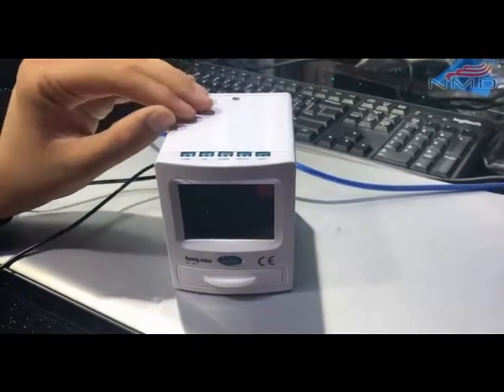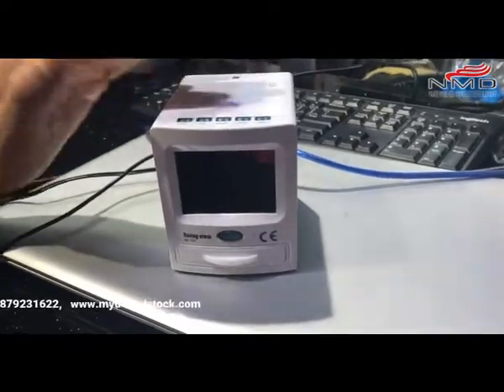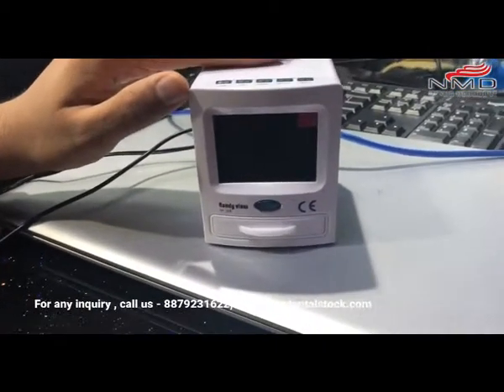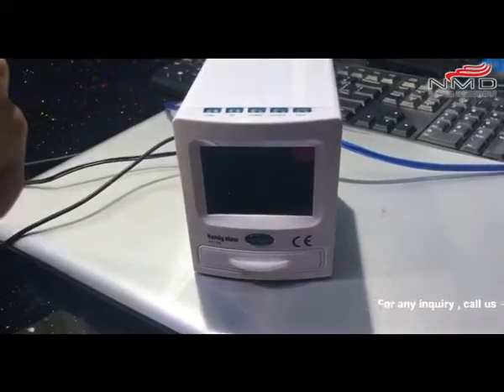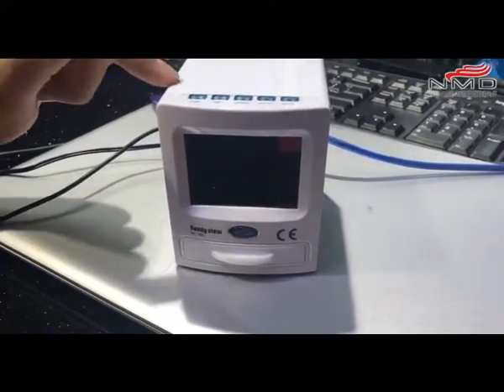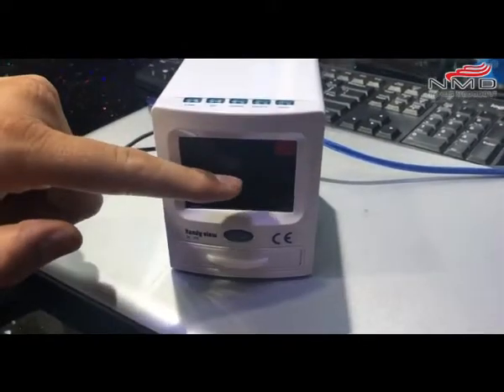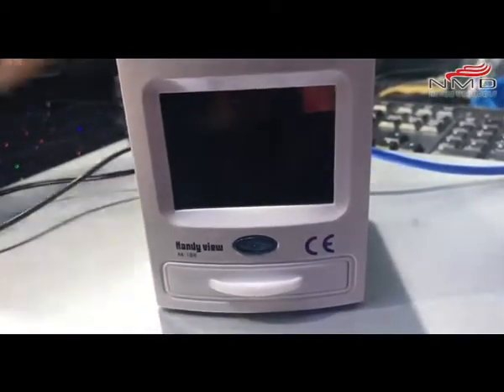Hello friends, we are back again with new technology. This is the IOPA film reader, and what it does is convert your X-ray films into digital format. It has a screen, and you can also see it on the TV, store the data, and transfer it to the computer.